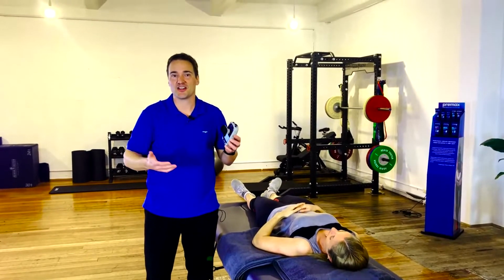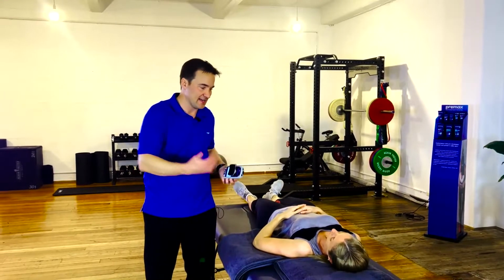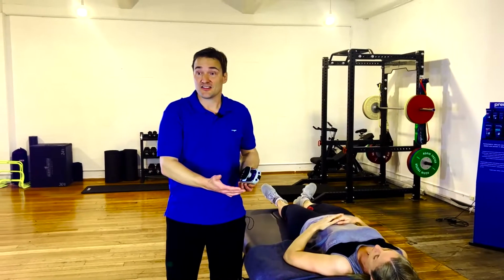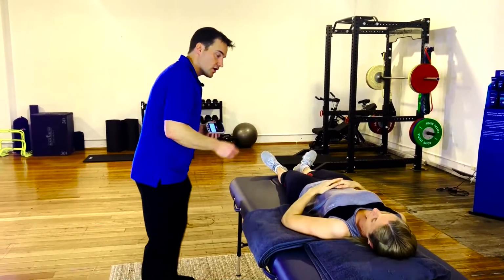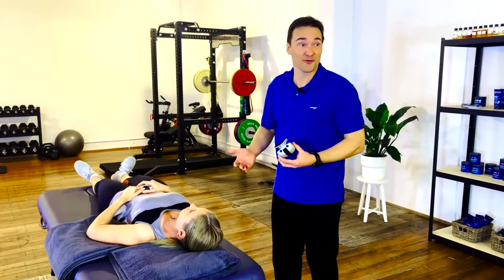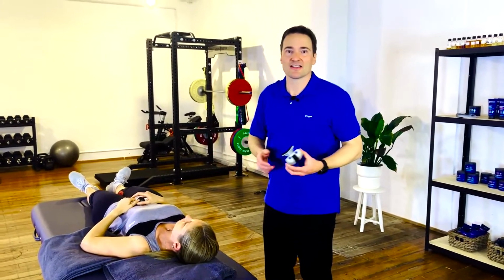So obviously you can make this as valid and as repeatable as you like by adding in rigor. If you're in a hurry, at least you've tested, okay? At least we've got a good measure. She looked like she was taking it seriously and giving that a big effort, and we can obviously convert that to torque. So in the interest of time, I won't compare to the other side because it will be exactly the same. You might have noticed my instructions. I think I started adding in go, go, go within my pushes. Potentially that doesn't matter too much, but we're trying to keep it as standardized as we can.